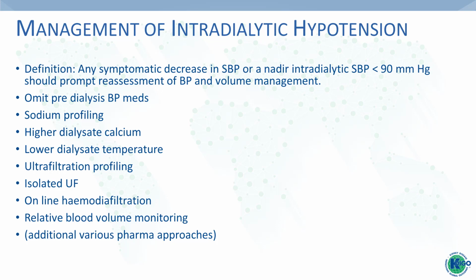Isolated UF is also important, as that can sometimes be more stable. And I think we also need to be looking at online HDF, which has more stable membranes as well, more stable ultrafiltration, as well as the use of more biocompatible membranes. Now, obviously, there's other pharma approaches to hypotension that we also need to be looking at.